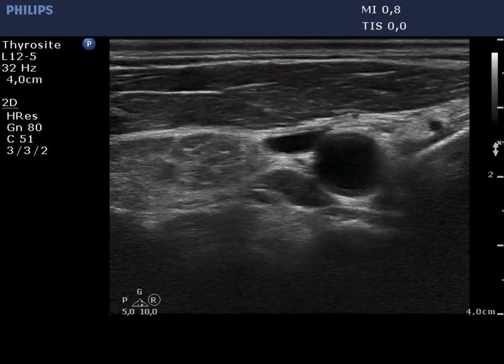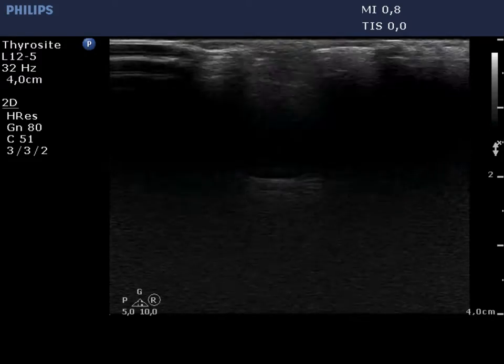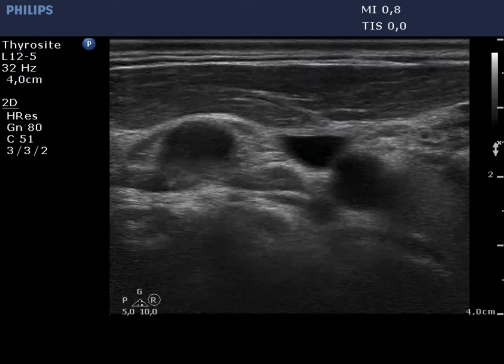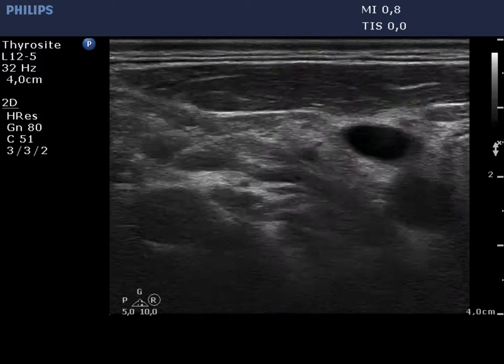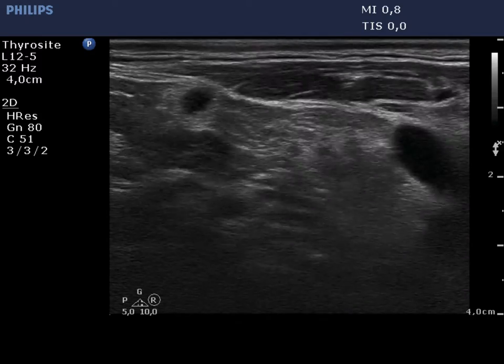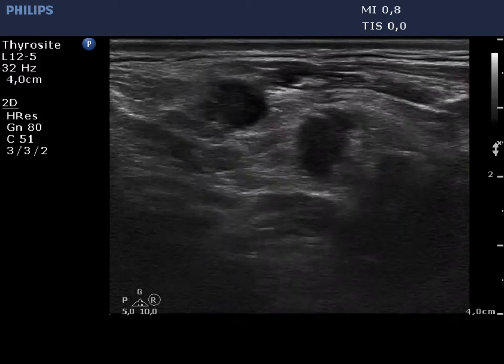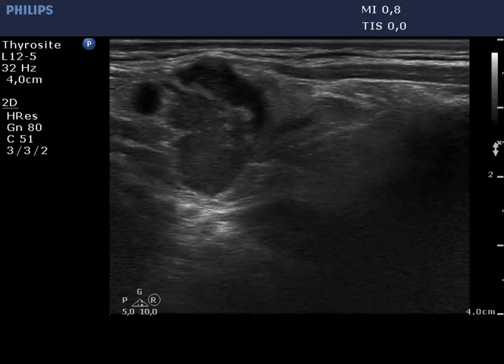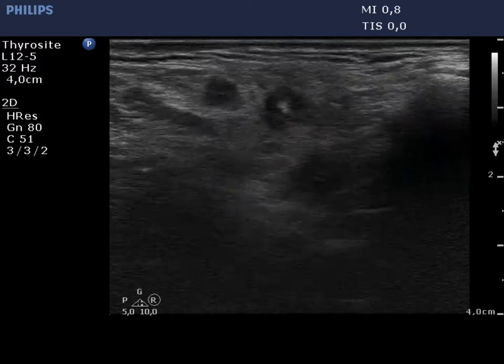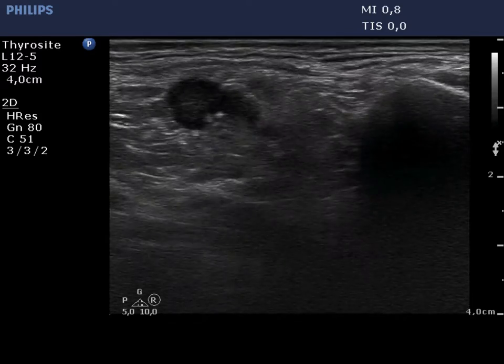The video starts with the right thyroid. Lateral to the thyroid, there are several regular, round hypoechoic figures. These are vessels.